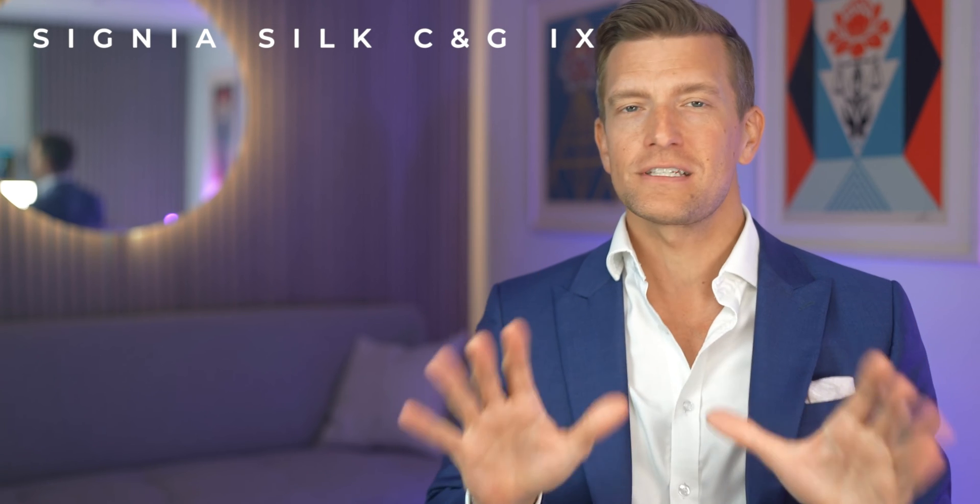Released in September 2023, the Signia Silk iX has superseded the Signia Silk X, which is now three years old and long overdue an update. Today I'll first fill you in on the physical side of things and show you how they look in my ears, and then we'll take a good look at how clever the technology is working inside these hearing aids.